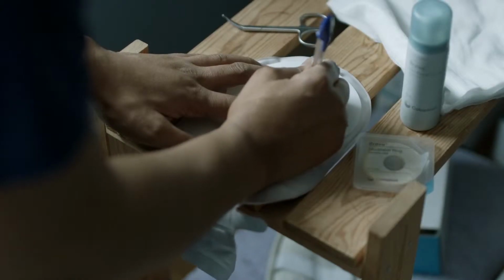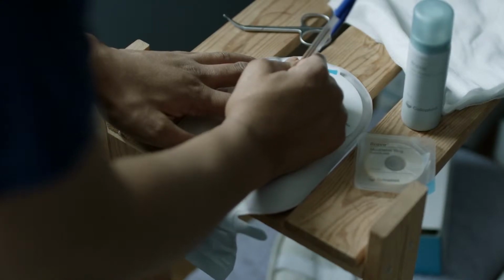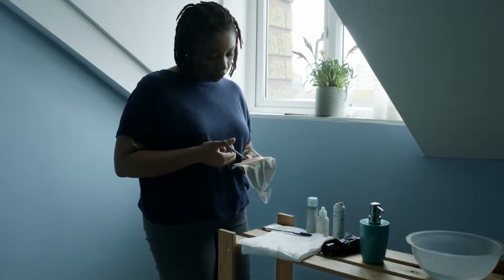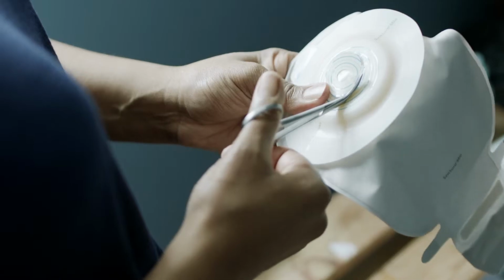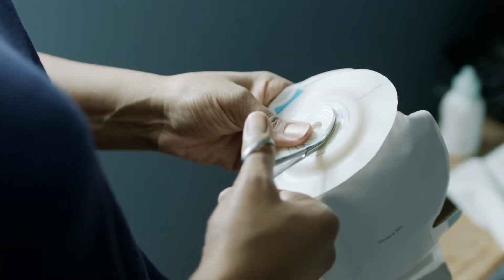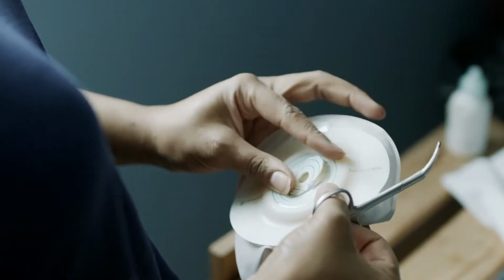My bag changing routine is as follows. I like to get my template out and mark up my bag and cut it just before I change my bag. I like to cut my own bags because the ostomy can change shape, and so I like to be able to keep an eye on that and make sure that my template is correct for my ostomy.